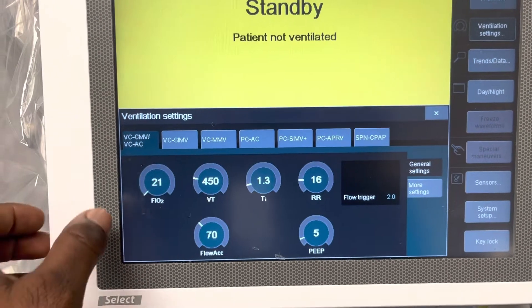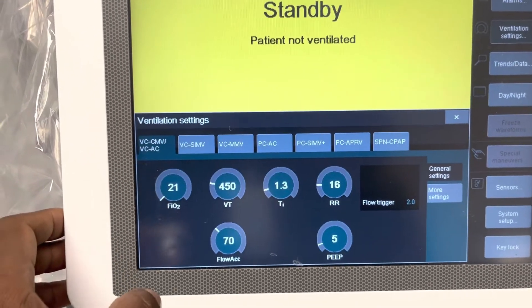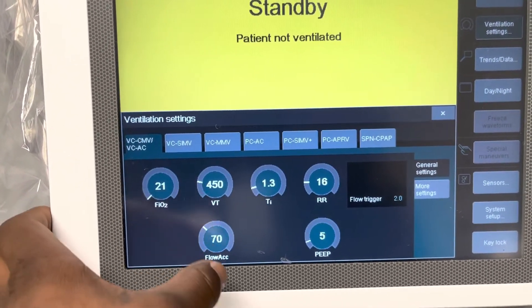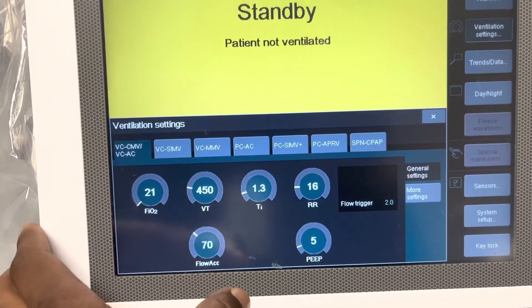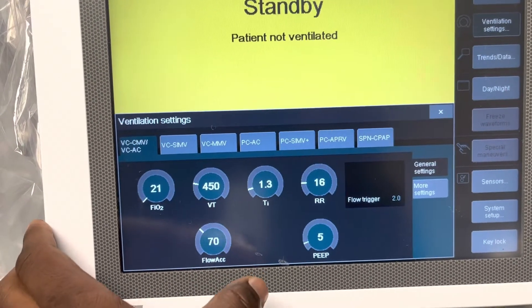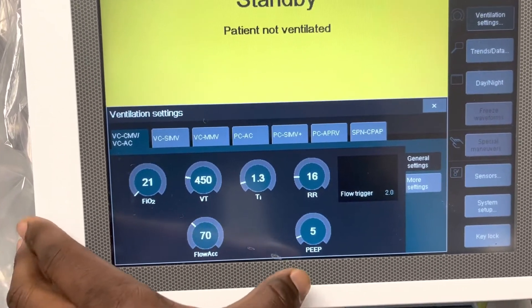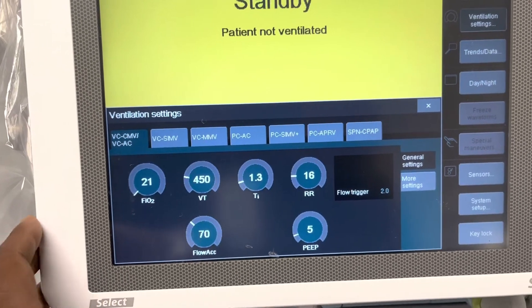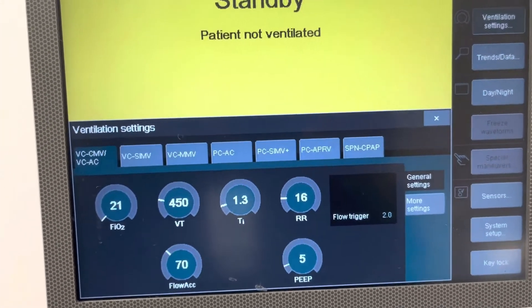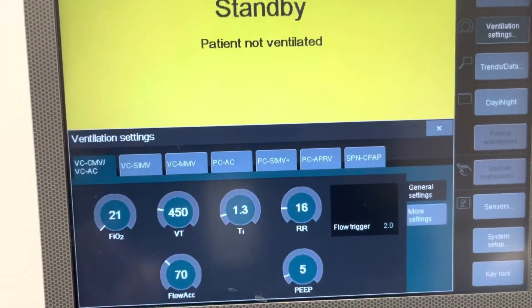Volume control parameters include FIO2, tidal volume, inspiratory time, rate, and PEEP — these are the commonly used parameters that we use.